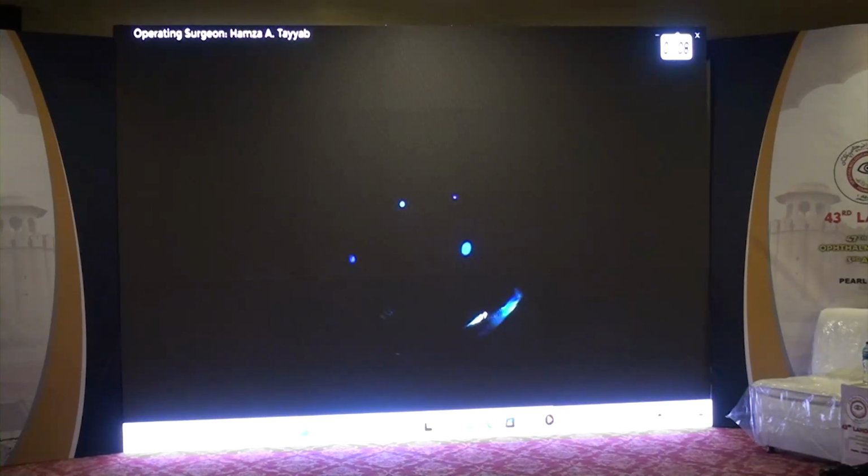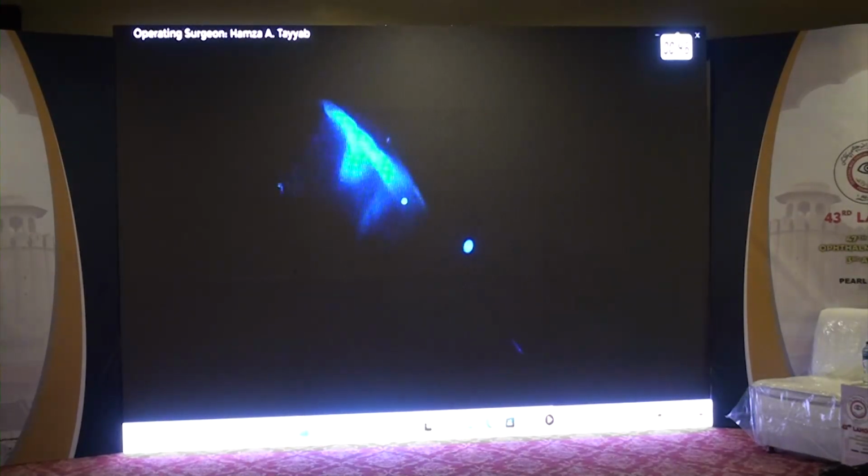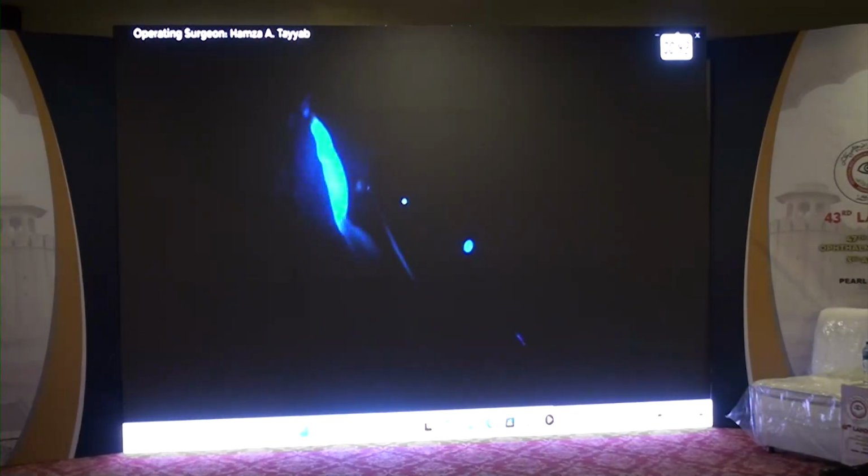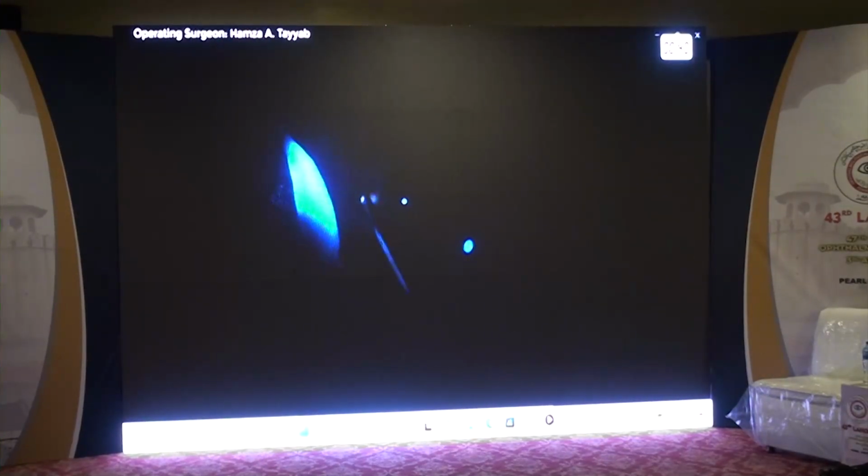The importance of removing this anterior border is that if we leave it, we can cause a neovascularization response from these ischemic parts of the retina after a few months. So better to remove them. And as you can see, the whole retina is 180 degrees folded on itself. The best tool to use is PFCL, heavy liquid.